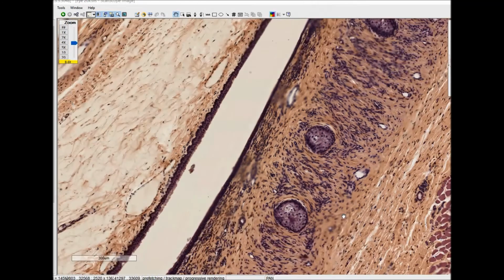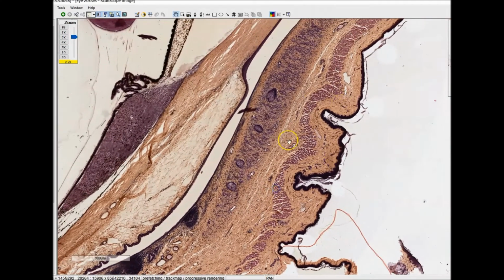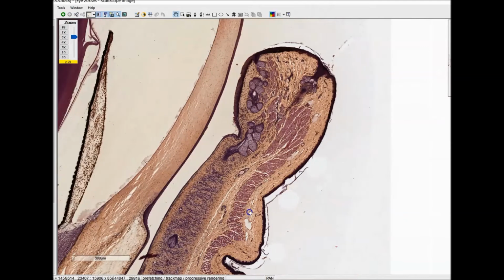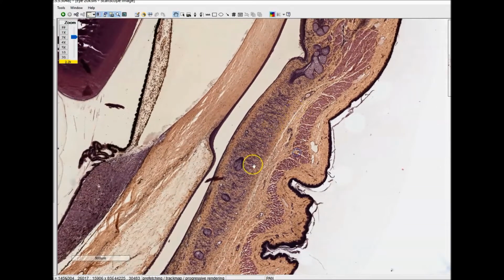We'll look at the eyelid again later on in histology when we look at skin, because we're going to look at some of the things that you see in skin and some of the glands that are present here. But for now, we'll just mention the conjunctiva and let you know that that's what this structure is, the eyelid.